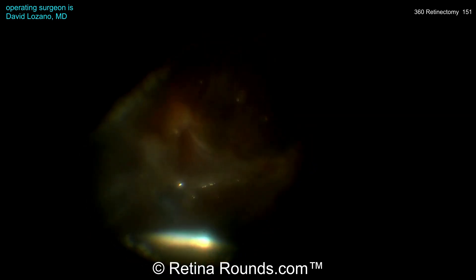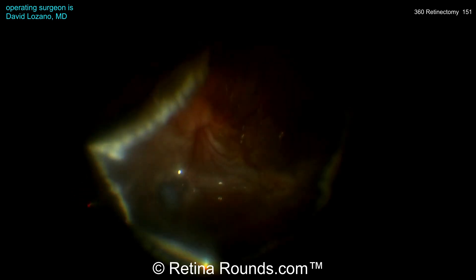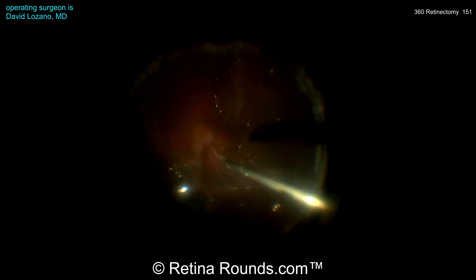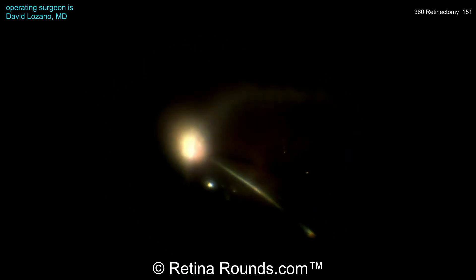Now you can see the inferior retinectomy is done, and very importantly, with the assistance of scleral depression, he's trimming back the anterior retina and trying to address as much of the anterior vitreous as possible. You can see those ciliary processes, and trimming back and cleaning up that anterior vitreous is going to help decrease the risk for anterior loop PVR, ciliary body retraction, and hypotony. Now the retinectomy has been completed 360 degrees. Some perfluorocarbon liquid was used to stabilize the posterior pole before creating the retinectomy, which helps ensure the retina is minimally mobile and creates a much more controlled edge.